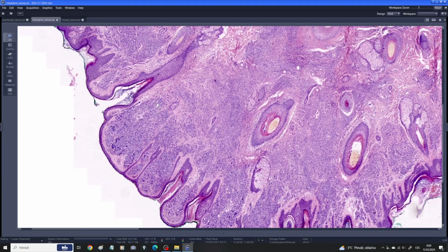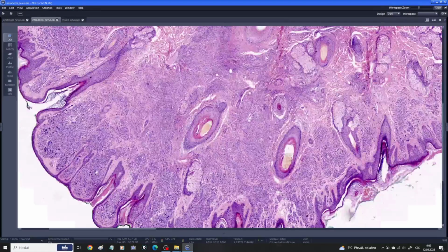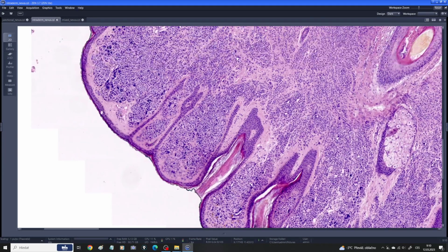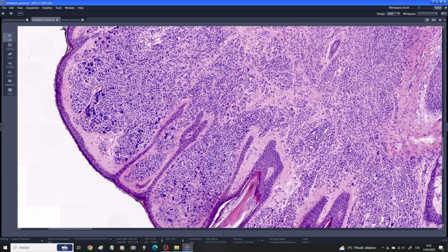As I mentioned before, very often they are verrucose, so you can see that the lesion is not flat, but forms a bulk. That's the first thing. And second, you can see that the lesion is situated just in the dermis. So the epidermis is intact, but the whole lesion is situated in the dermis. So this is an intradermal nevus.